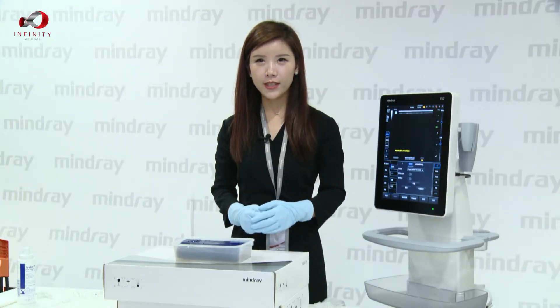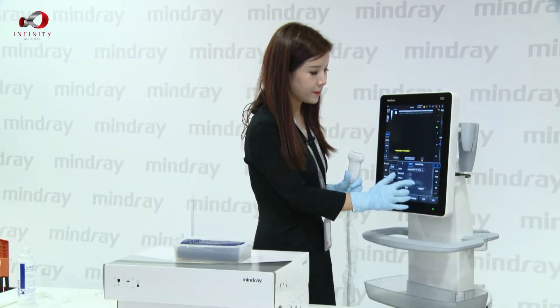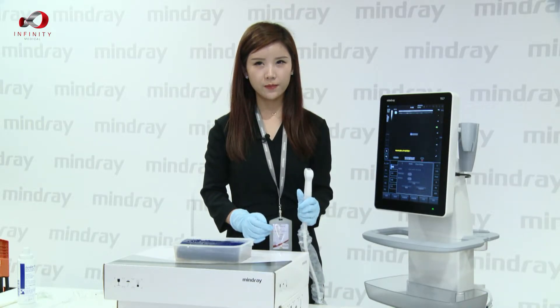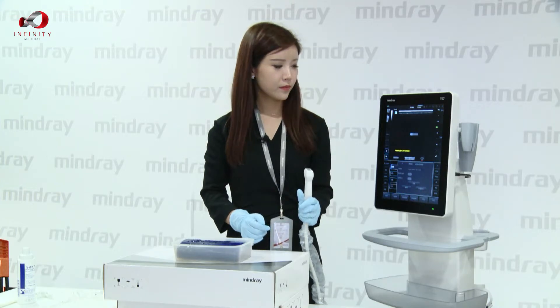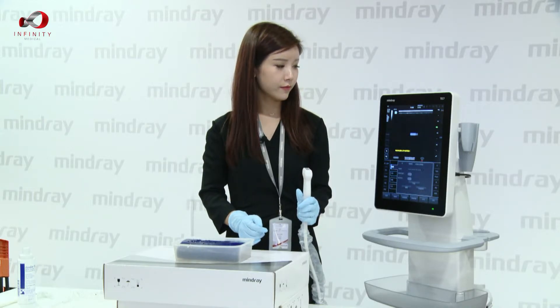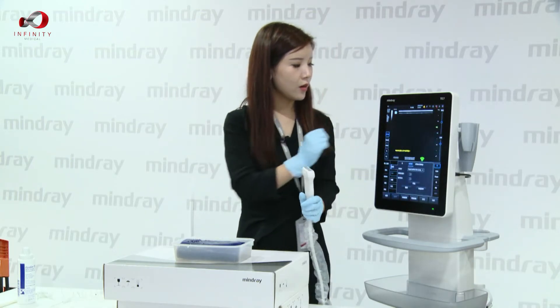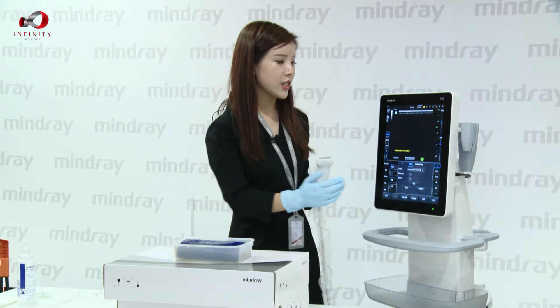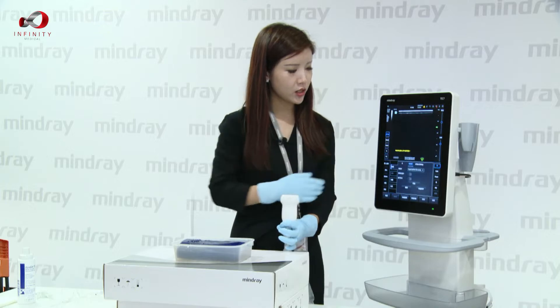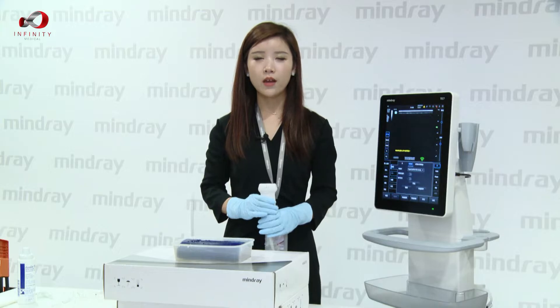For calibration, we just simply click the calibration button on the screen and hold our probe firmly. Wait for a few seconds. Once the process has been done, we can see the signal turns green on the machine. Then we can start our demonstration.